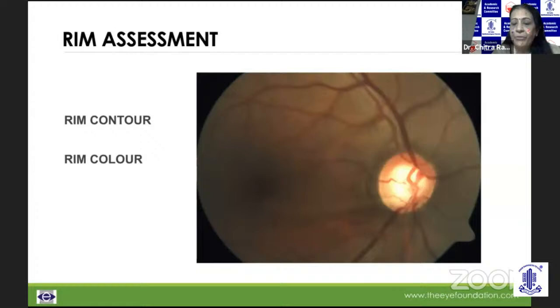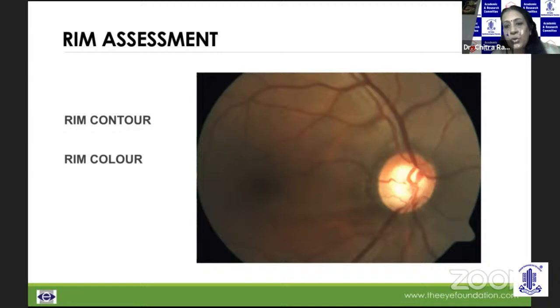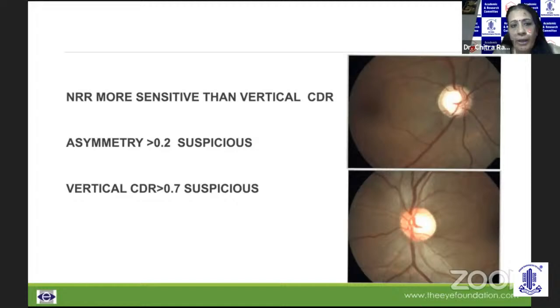The rim color could be orange to pink, and if there is focal pallor, we need to look at it with attention. We need to look at the rim configuration — whether it's getting thinned out, whether there's a notch, and how the vessel travels over it. An NRR evaluation is a lot more sensitive than the vertical CDR.